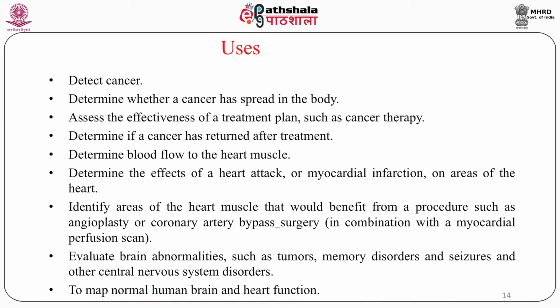Determine the effect of heart attack or myocardial infarction on areas of the heart. Now, if a person has had a heart attack and you want to know how much of the heart is damaged, how much infarct has taken place, this is one of the most important techniques to come to know the place where the heart attack has taken place and how much heart muscle has been damaged.